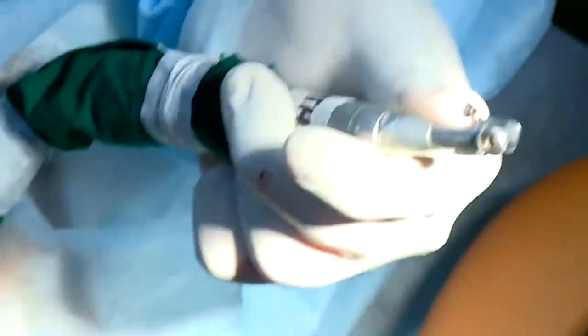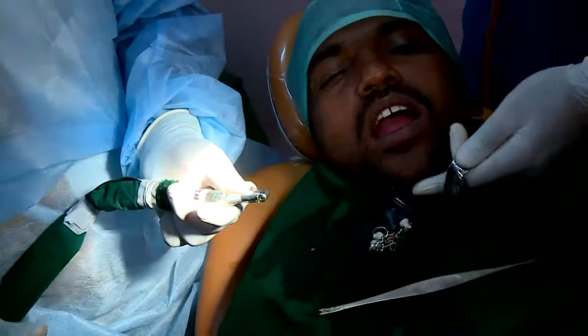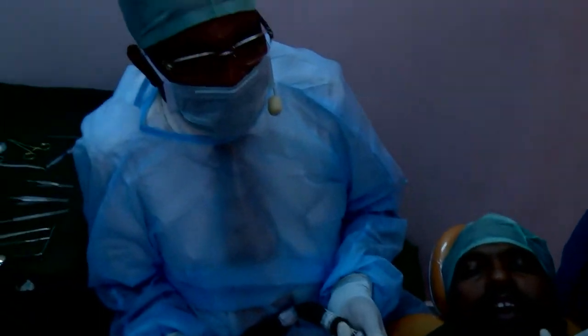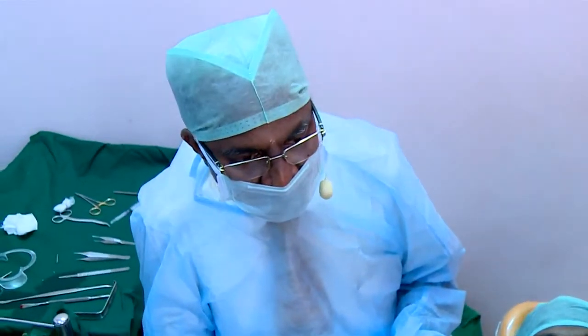But honestly, nowadays, we have come to an age where certain investigations are freely available. If you are doing an X-ray only based on IOPA or OPG, and everything was normal, nobody asks a question.